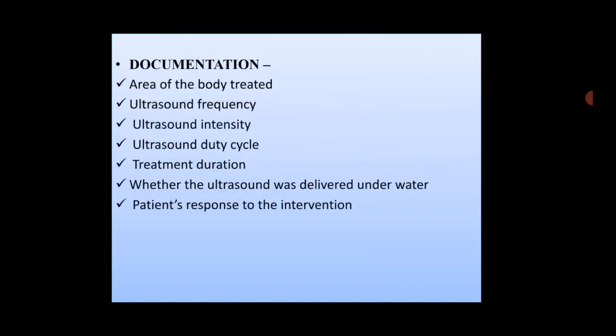Then winding up. Switch off the knobs and clean up the area of the treatment and then the sound head. Finally, you will have to document. You have to document the area of the body you have treated, frequency, intensity, duty cycle, treatment duration, and whether the ultrasound was delivered underwater, like what method you have used and how you have delivered the ultrasound. The patient's response to the intervention should also be noted.